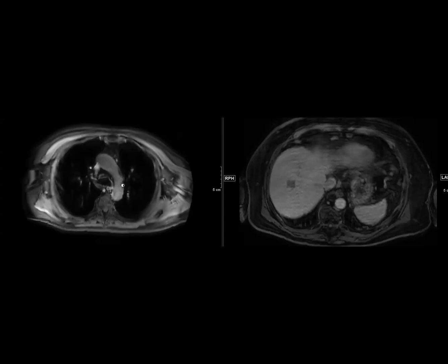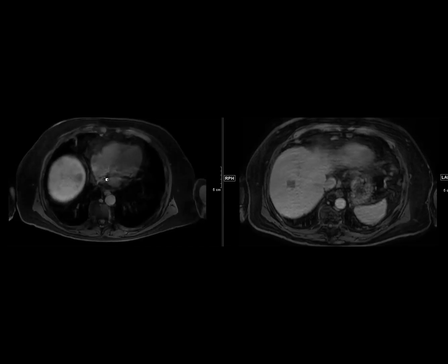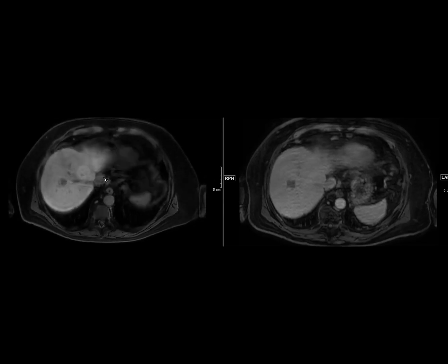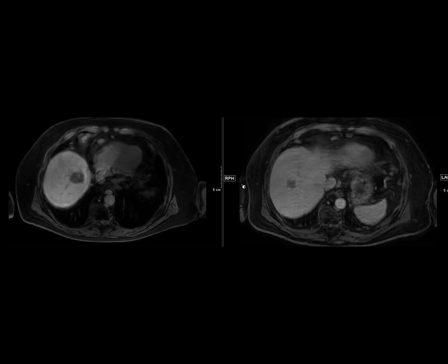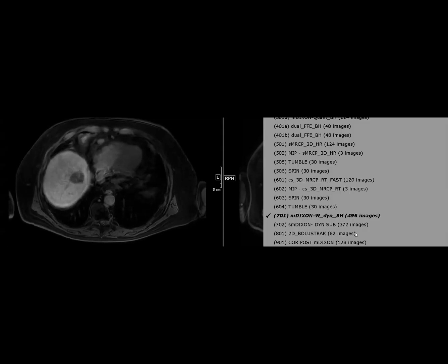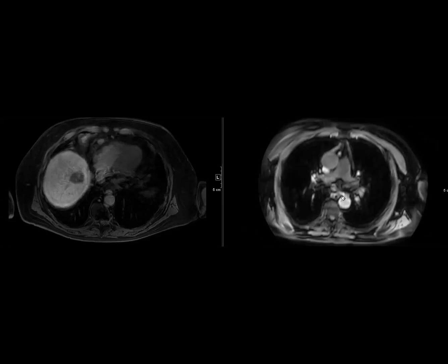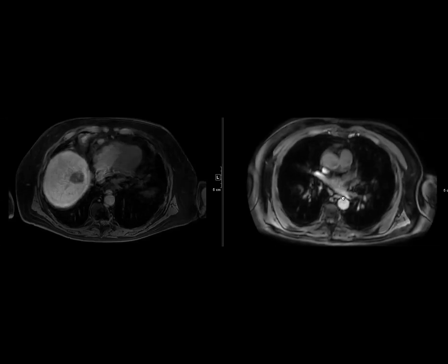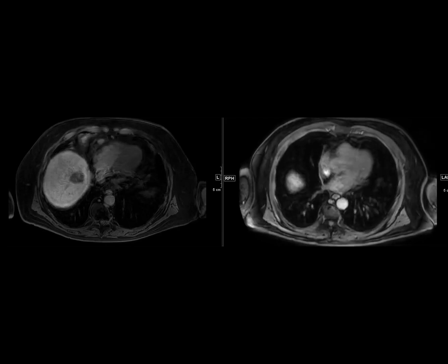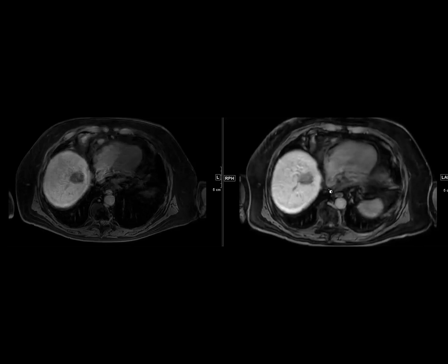Again, obviously nothing always follows the rules, but in general, non-HCC malignancies do tend to grow faster than HCCs do. So for example, here you can see this lesion stayed the same if we look at the same phase. So anyway, these are two interesting points about this case: even though the patient had a primary malignancy once, in patients with cirrhosis, LI-RADS 5 criteria are quite specific for HCC.